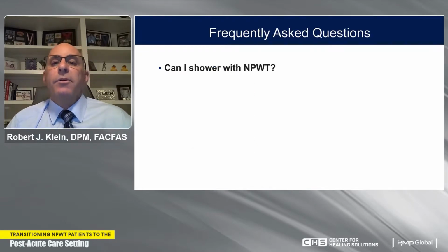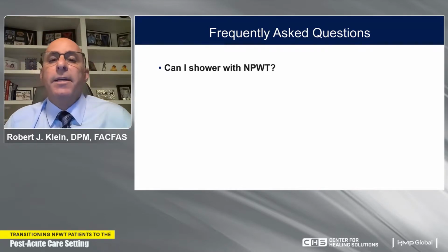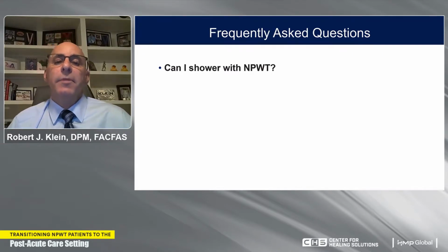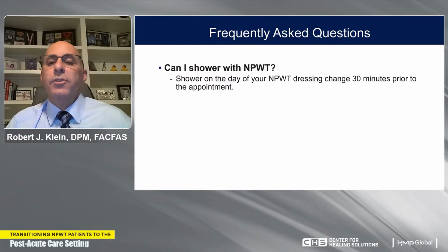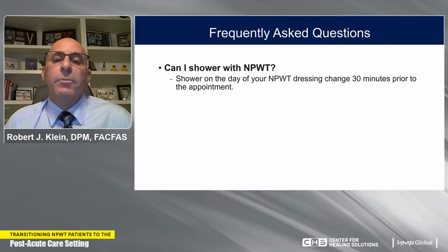Frequently asked questions regarding negative pressure wound therapy. I have patients all the time when we recommend negative pressure wound therapy. They have a lot of questions that they ask. And one of the ones that I hear routinely is, can I shower with my negative pressure wound therapy device? And what I tell my patients is, go ahead and shower with your negative pressure wound therapy device, but do it about 30 minutes prior to either their next appointment or 30 minutes prior to when the home health nurse is scheduled to come out to do their negative pressure wound therapy change.